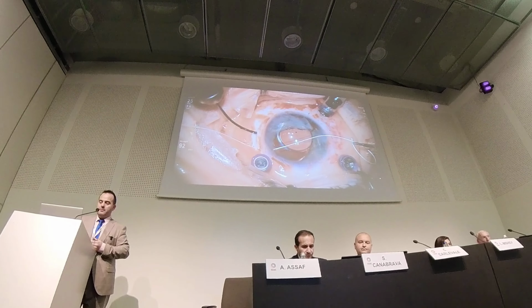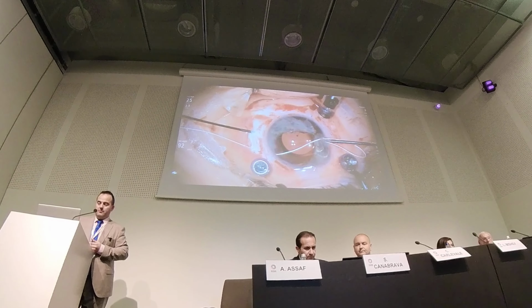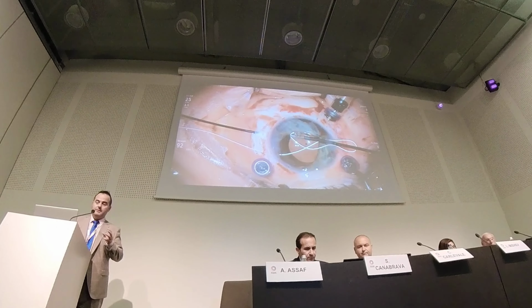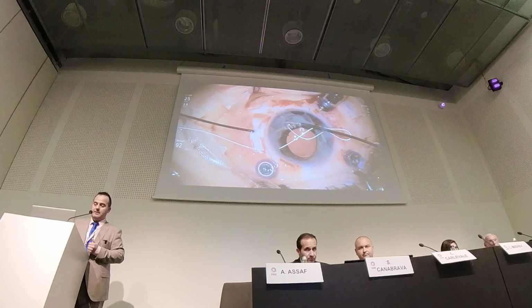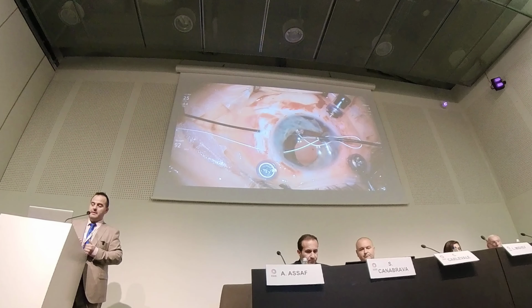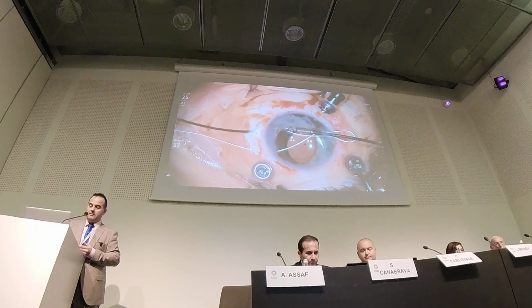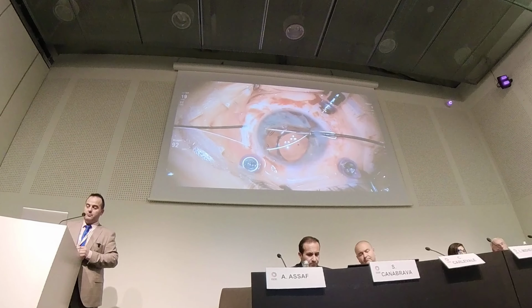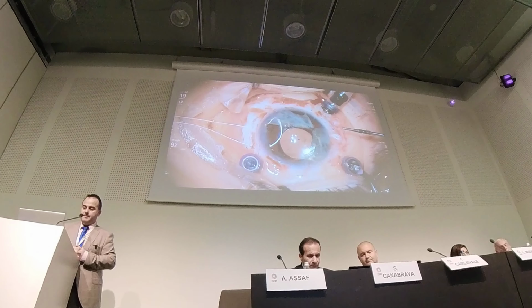Why do I show this? Because here I already made some iridoplasty, and we need to preserve this fragile construction. And anyways, I will be able to Gore-Tex suture this IOL without damaging the rest of the iris or the delicate structure that I try to create, because I will try to finish it with a fairly good aperture size. So I need to create some pupil here.